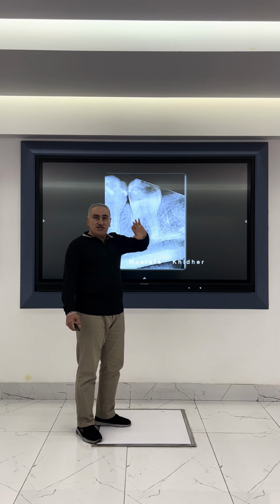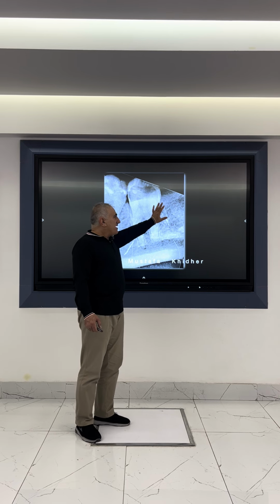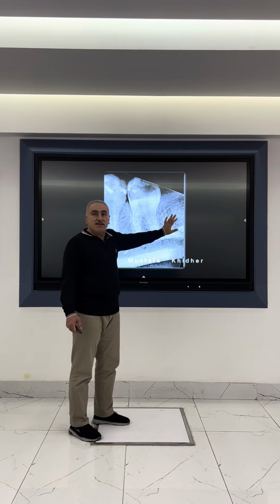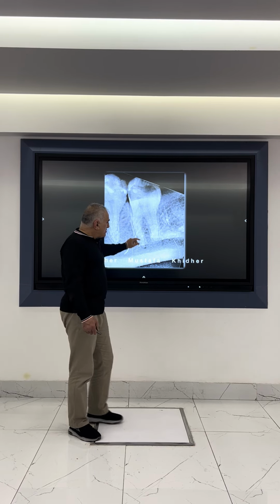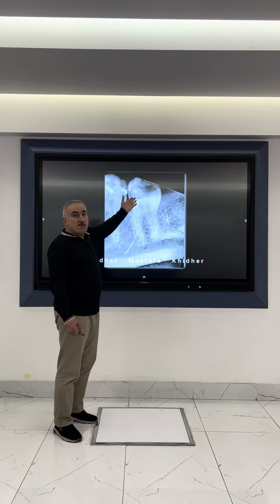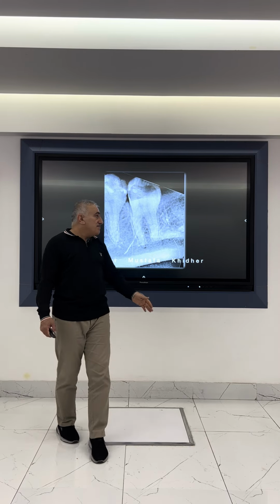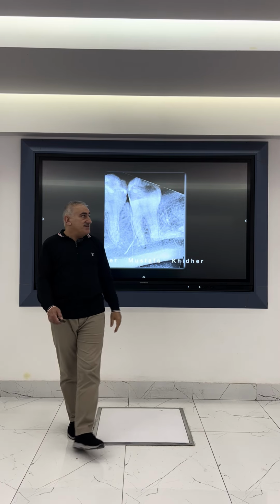As she is from far away from our city, she came and extracted this tooth on the same day. We decided to finish the case and do root canal therapy for this. You see there is a little change in the case, but really the case is far from the pulp. So why did she get infection? Because she got infection from this lower 8. So it is chronic pulpitis.